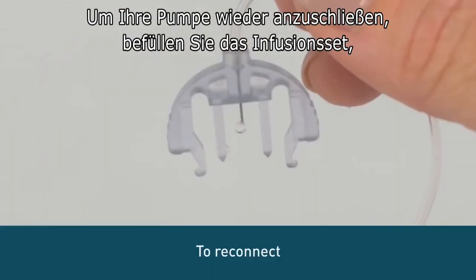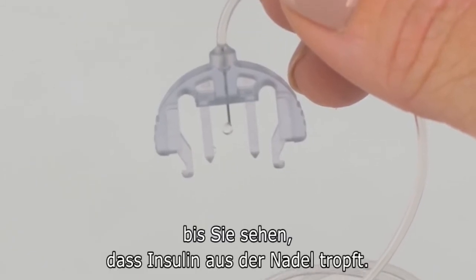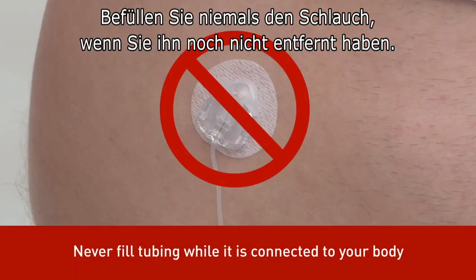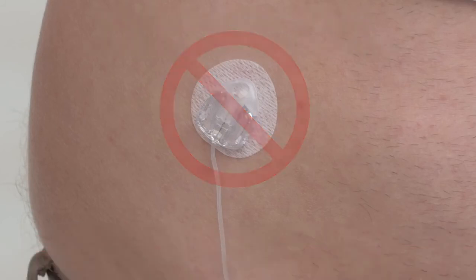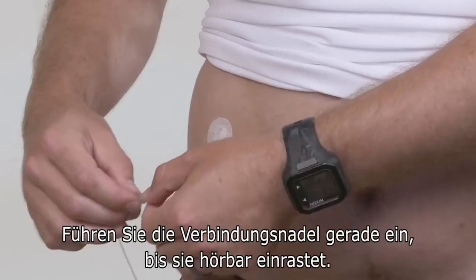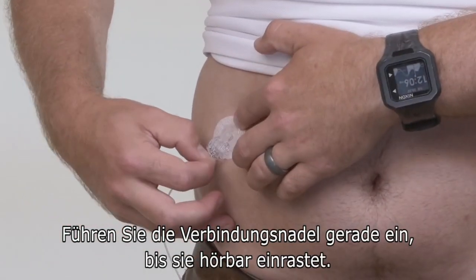To reconnect your pump, fill the infusion set until you see insulin drip from the needle. Remember to never fill your tubing unless your set is disconnected. Now remove the cover from the cannula housing. Place your finger in front of the cannula housing and push the connector needle straight in until you hear a click.